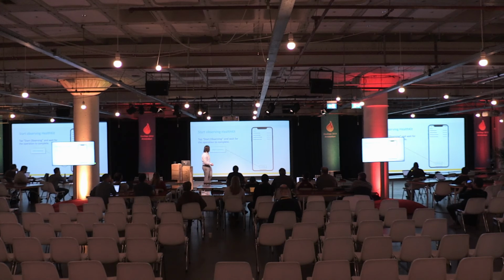So when you click the Start Observing button, this actually sets up those observer queries using the HealthKit on FHIR framework. It's going to connect into HealthKit and say, I care about these types. So the types we're actually looking at right now are going to be heart rate, step count, blood pressure, and blood glucose. The heart rate and step count messages are actually sent up using the IoMT FHIR connector for Azure, and that's because they can be high frequency. Blood pressure and blood glucose in the sample app, they just write directly to FHIR.